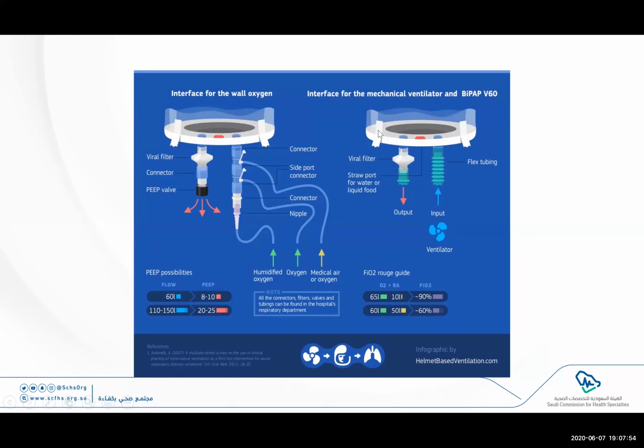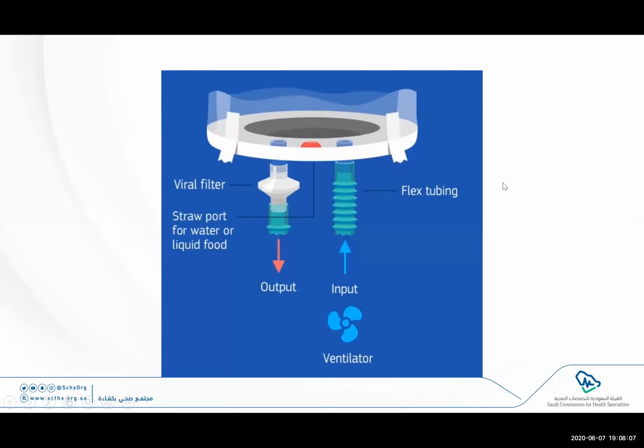And this is the second system, which we are going to be talking about basically, and we're recommending its use in the kingdom, which is basically utilizing a ventilator. So if you zoom in, as you can see, the ventilator is here, the inspiratory limb is connected there, a filter is connected to the expiratory limb only, and then the expiratory tube is connected. And we're going to go into more details later into these connections and how we can troubleshoot some of the problems.